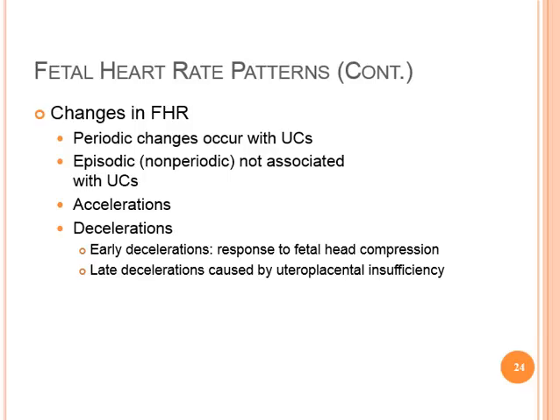It's good to know that before 32 weeks of gestation, the definition of an acceleration is a peak of 10 beats per minute or more above the baseline and duration of at least 10 seconds. Acceleration of the fetal heart rate for more than 10 minutes is considered a change in baseline rate, because usually your accelerations don't last for 10 minutes at a time.